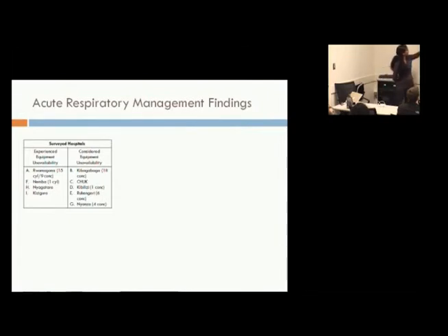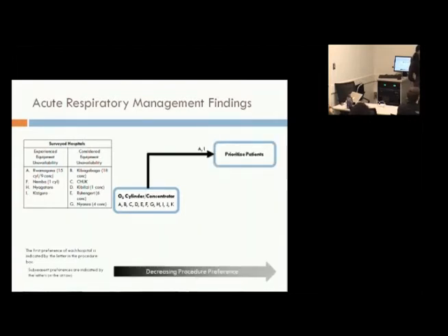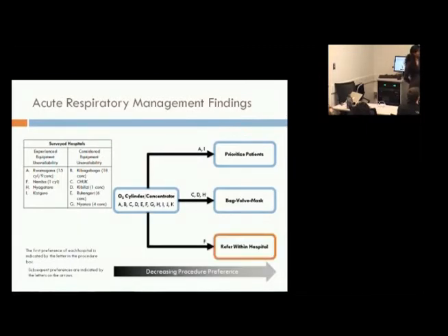Only 9 of the hospitals I visited actually had trauma wards, and of those, 4 experienced equipment not being available, while 5 told me what they would do in that situation. Again, the first preference for everyone was using either an oxygen cylinder or concentrator. In 2 cases, when this is not available, they switch to prioritizing patients. What that means is the patient that has the highest likelihood of surviving is given treatment first. Once that patient is stabilized, then they will move on to the next patient. In 3 cases, they only use ventilation using the bag valve mask. And finally, in 1 case, they will refer to a different service within the hospital that had different equipment provision.